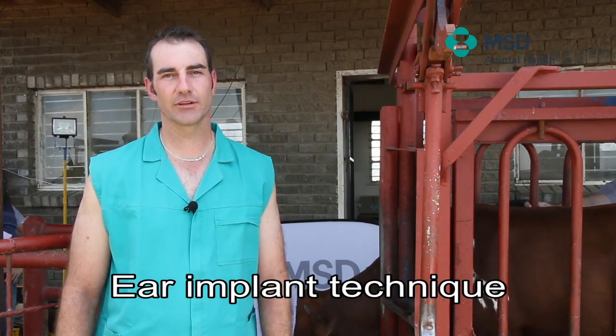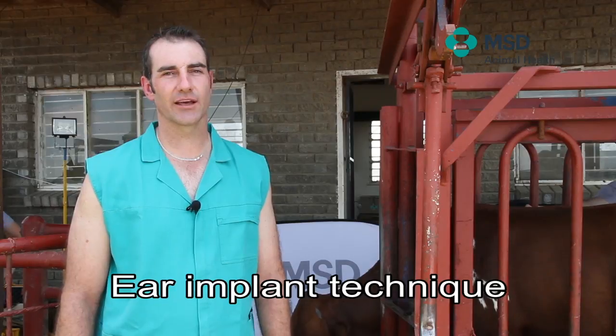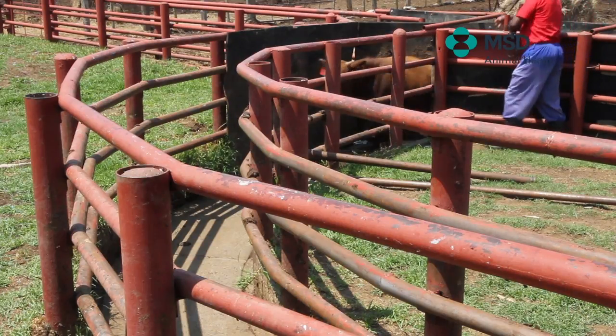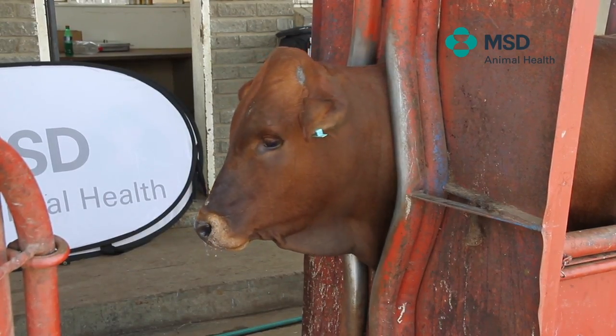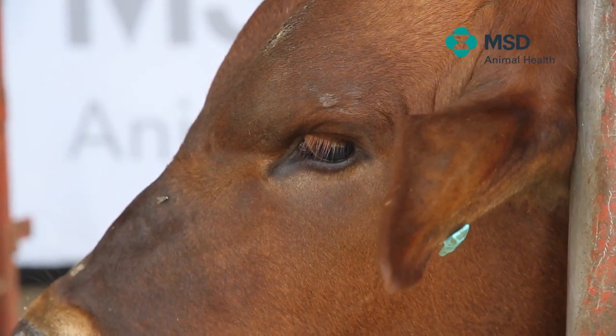In this video we will be explaining the correct ear implanting technique. It is of paramount importance that the restraint of the animal is done correctly. If not done correctly, this can lead to serious injury to the implanter as well as the animal. Before implanting, make sure that the gun and the needle you're using are sharp and clean. And also make sure that the ear is free of mud or feces. This can lead to bacteria entering the wound and causing an infection and the implant not working optimally.